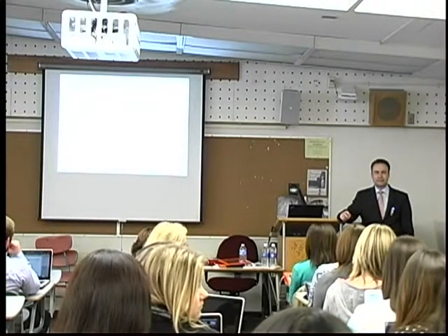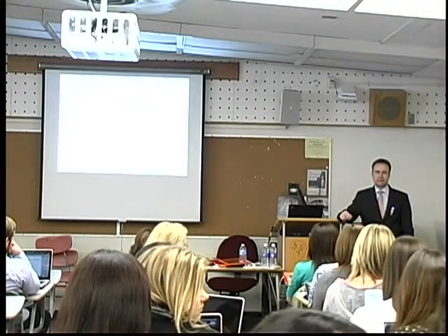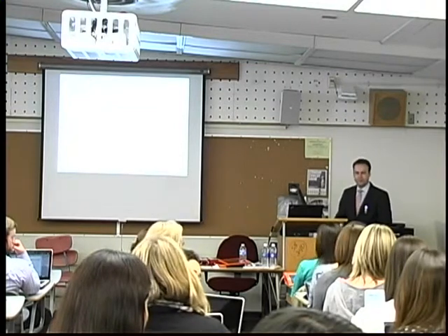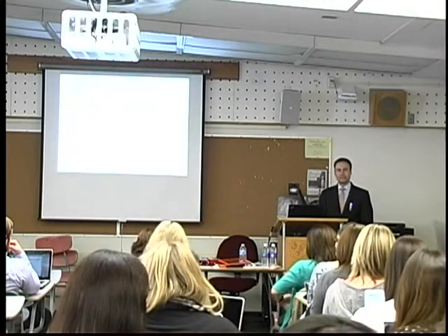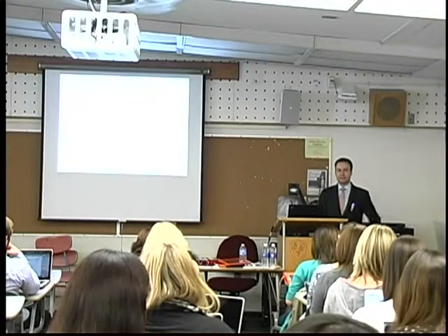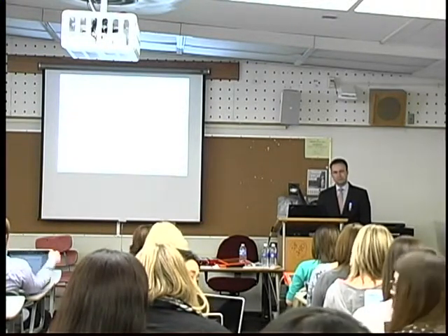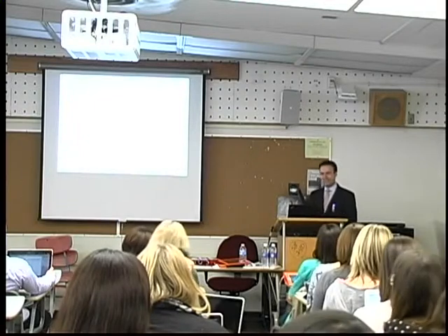And then do we have to write a report after that 13 months to validate that, in fact, it's the right device for the person? Do you know? So after 13 months, we have to write another report. We do a cycle to reevaluate whether there is continuing use and things like that. I think that makes sense. And if the trial is longer, if somehow you're hospitalized and cannot use the device for over 60 days, I believe, then you might extend the trial. Yeah, there's lots of stuff happening at that end.